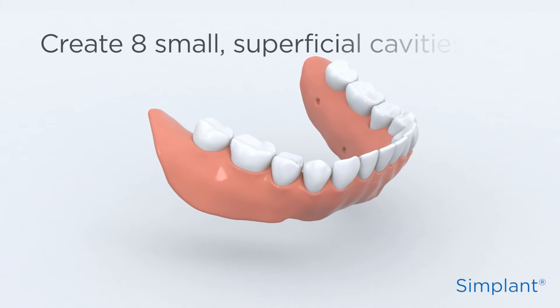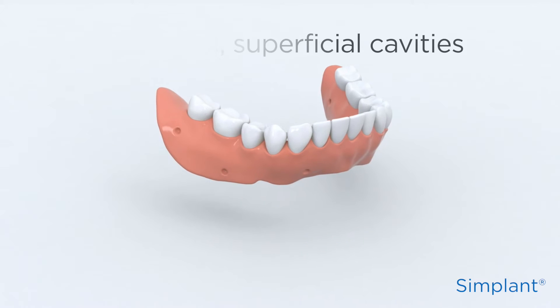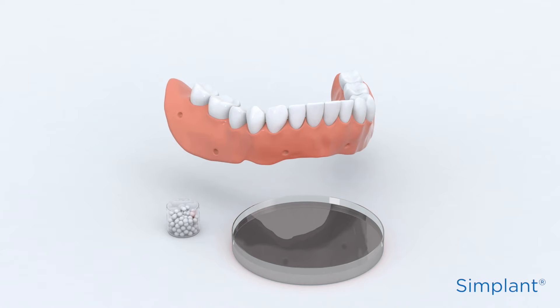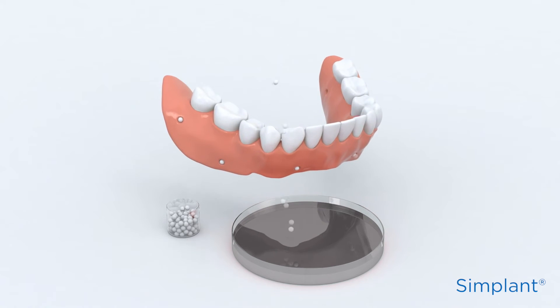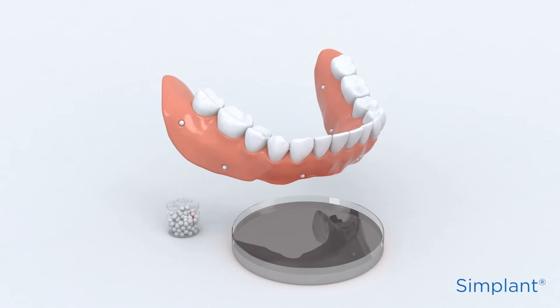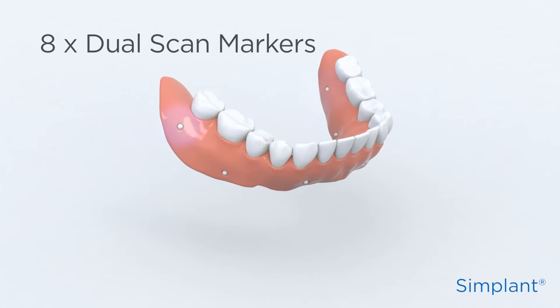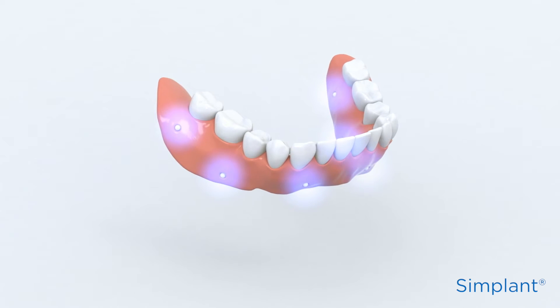Create eight small superficial cavities spread across the prosthesis. Dispense a drop of radiolucent resin — for example, Triad Dual Line from Dentsply. Submerge a dual scan marker and place the resin with the marker into a cavity. Repeat these steps to add all eight dual scan markers to the prosthesis. If necessary, you can light cure to reduce the curing time.